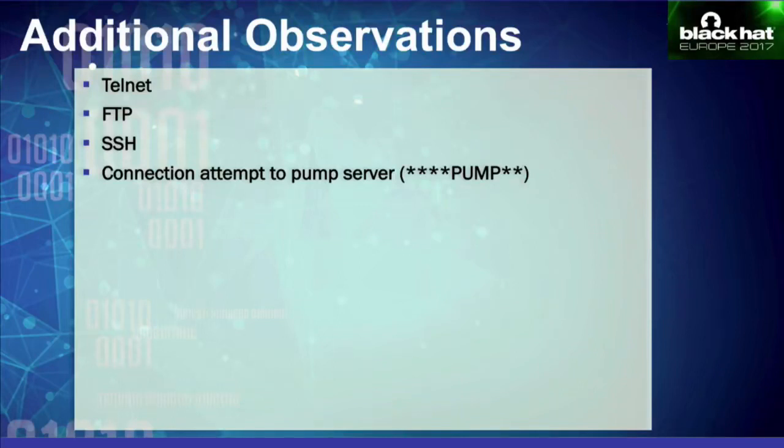Once that was done, we also installed Wireshark on it, just to capture network traffic. As that happened, we saw that the infusion pump instantly tried to reach out to the pump server. Now it could resolve the name of the pump server, so it started sending some packets to it.